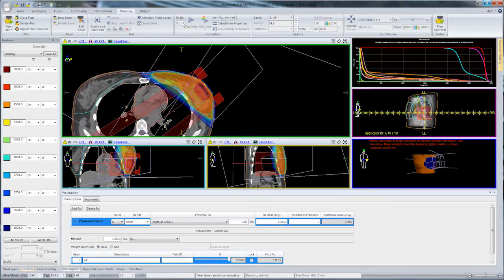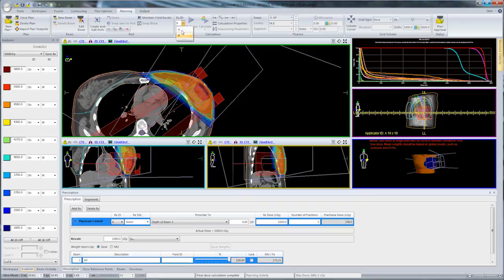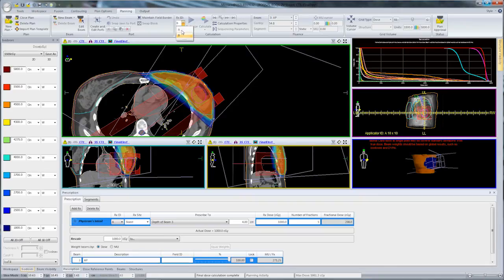If we need to, we can always flip between the different prescriptions and make changes to beam weights, beam placement, and other parameters, all on the fly until we have a satisfactory plan that we want to treat with.